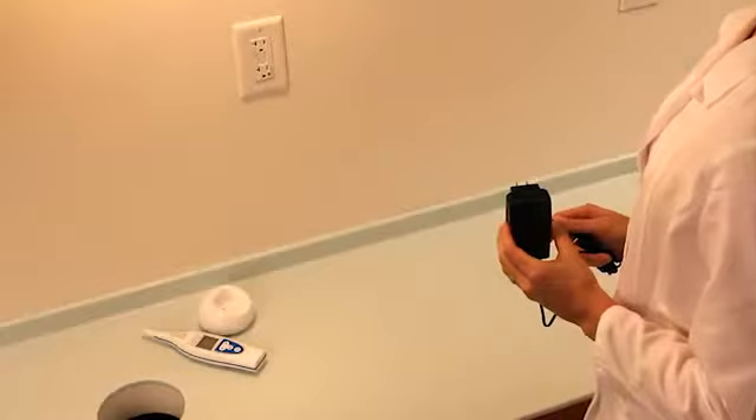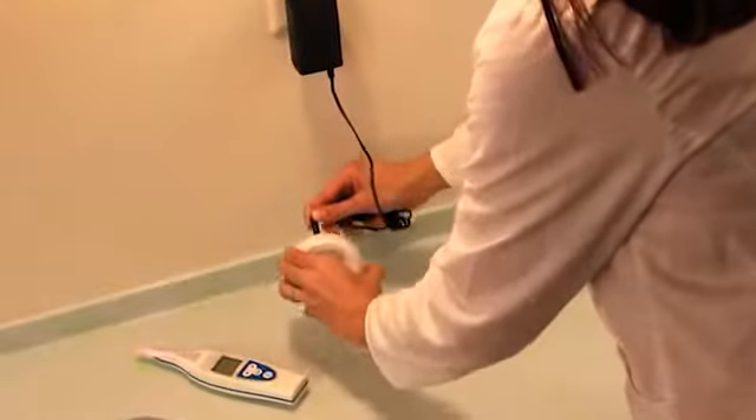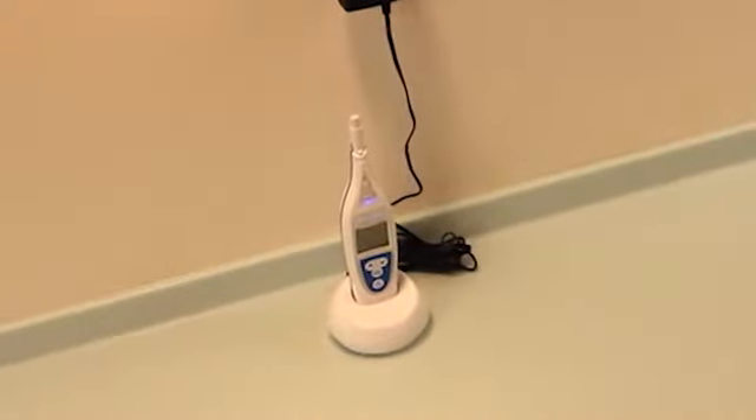Find a place in your operatory to plug in the cradle charger. This is what holds your CareyScan Pro when you're not using it, and it also charges your CareyScan Pro so it's always ready to use. Your CareyScan Pro requires three hours for a full charge.